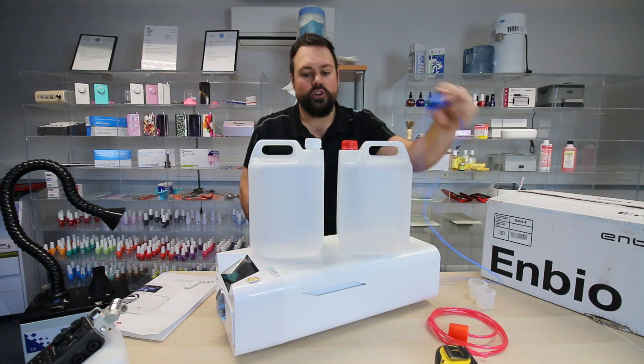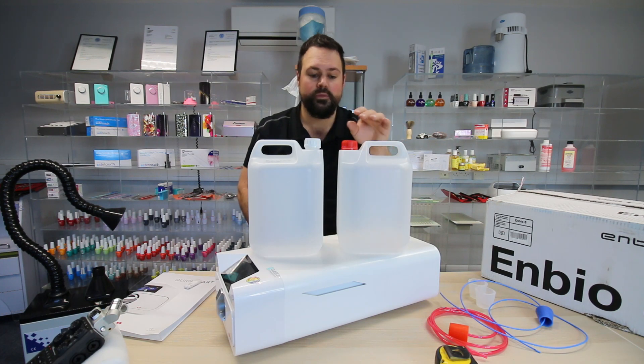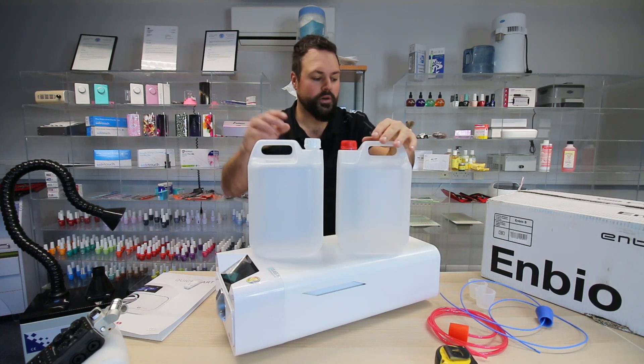The bungs go in the top of the bottles and plug into the back of the machine. When we talk about the programmes and the initial setup, I'll go into that in a bit more detail.